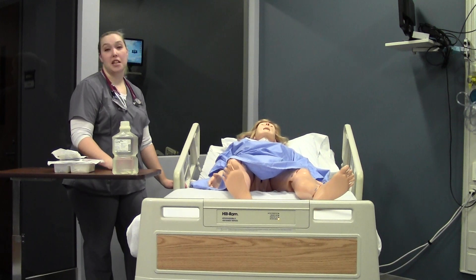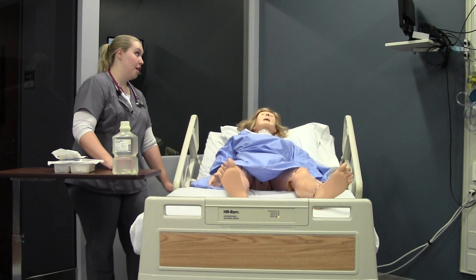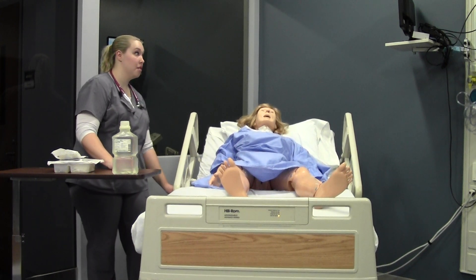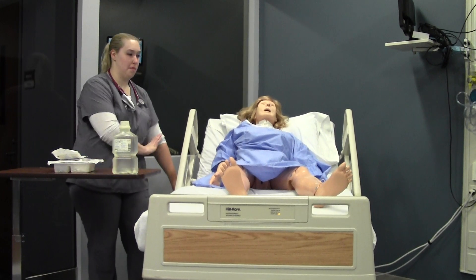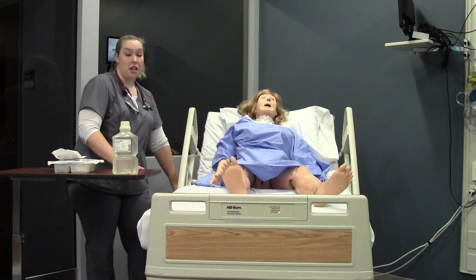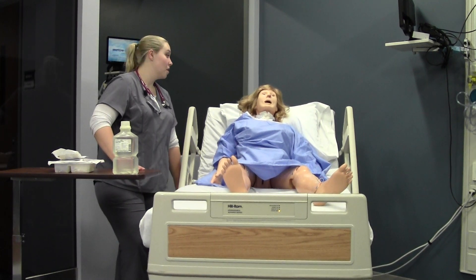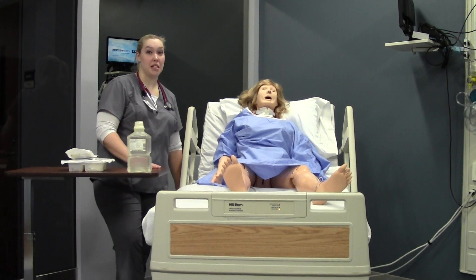You'll need your patient to sit in a semi-Fowler's or high-Fowler's position, and you'll need to drop your bed rail down. You'll need your suction tubing and an Ambu bag as well. You will need a partner for this so they can bag your patient intermittently while you're getting everything ready so that you can stay sterile.